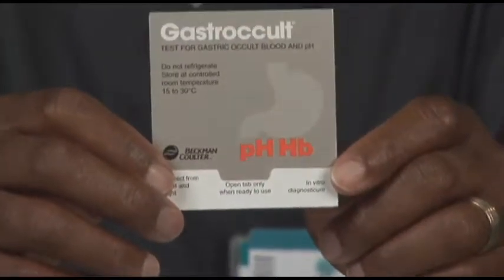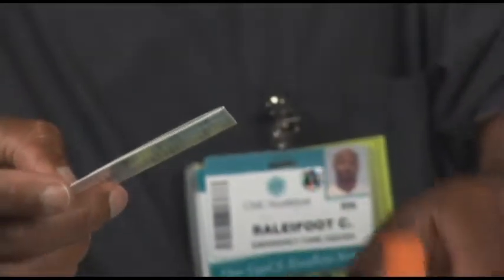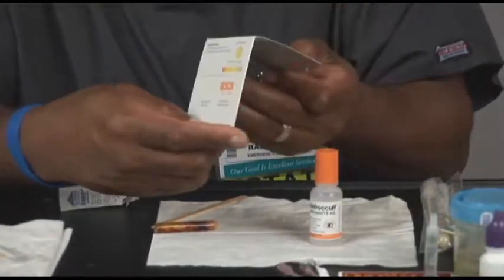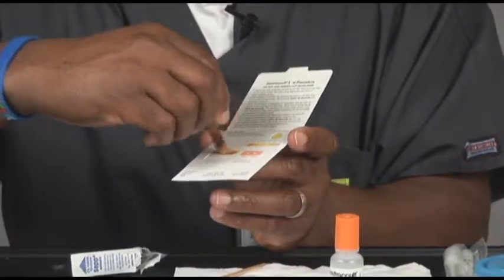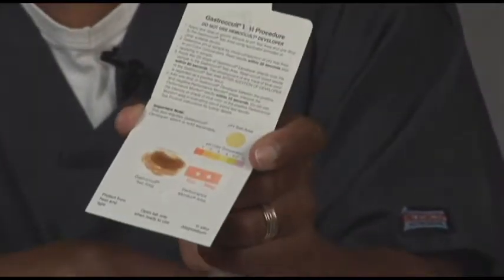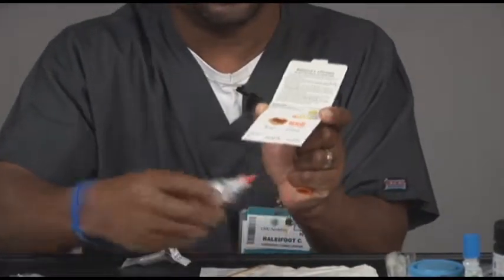This is used on any emesis, and with this one, you only need to put the specimen on one side, and the developer for that has an orange cap to it, so you can't mix the two. So if the doctor orders gastrocult on emesis or NG tube aspirate, you would use this here. So we're going to use the same fake specimen here. You smear your emesis on the specimen window. You place a drop on your orange control tab. Place the drop in between.